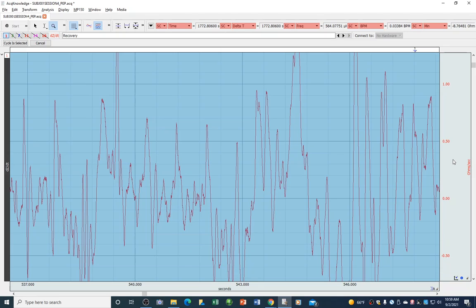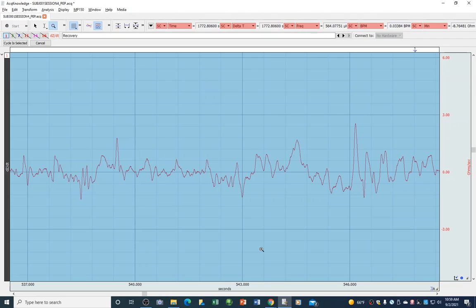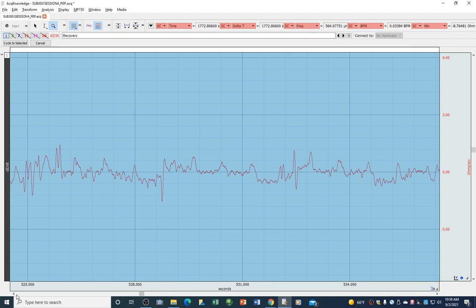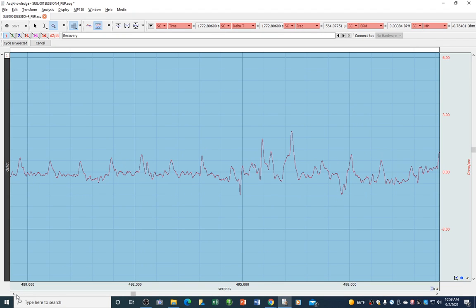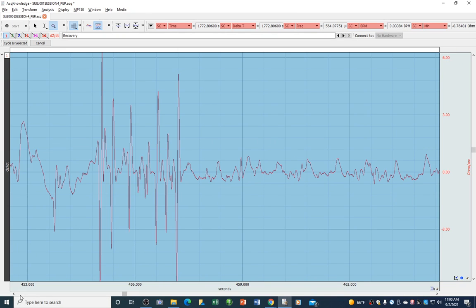Now I'm going to make my scale much wider. So instead of 0.5, I'm going to make it a 3, and try to see if I can see something out of this that's salvageable. But this is a great example of pure noise. These three things might have some rhythmicity to them, but almost nothing else. Let's see what else we can find.